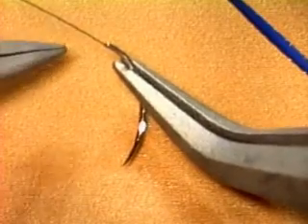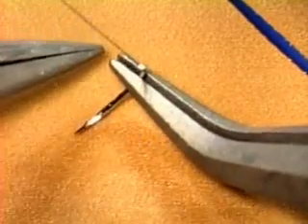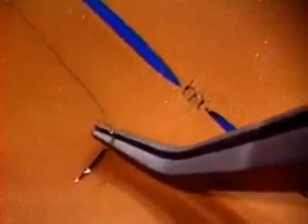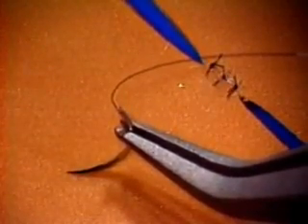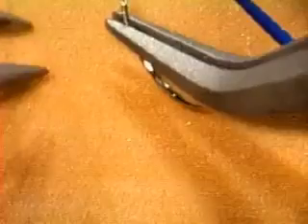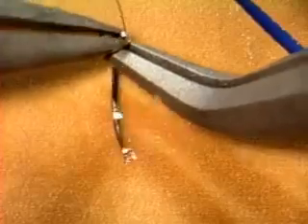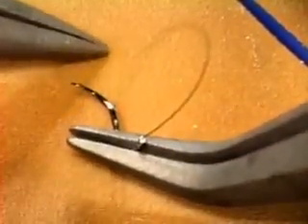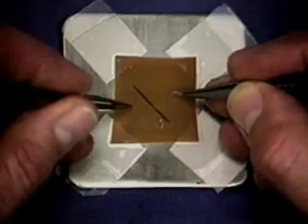If the needle is tilted on its horizontal axis, correct it by giving a light touch with the other pair of forceps. You can also correct mal-rotation in either plane by this simple maneuver: touch the underside of the needle on the underlying surface and drag the needle backwards while momentarily slackening your grip. Two mistakes to avoid: first, coming at the needle first with the needle holder usually leads to an unsatisfactory pickup. Second, trying to correct mal-rotation by working on the needle with both pairs of forceps at once tends to make a bad situation worse.